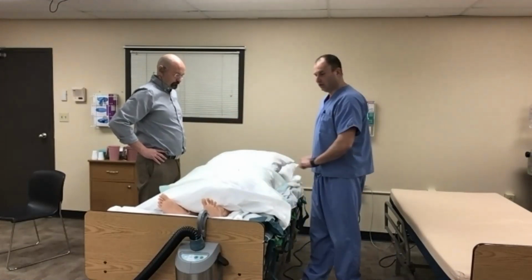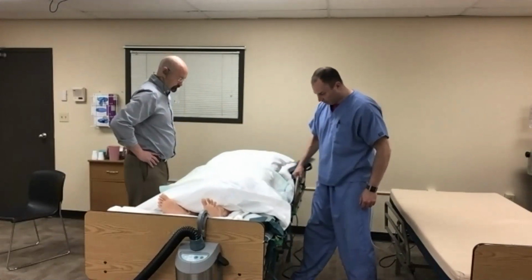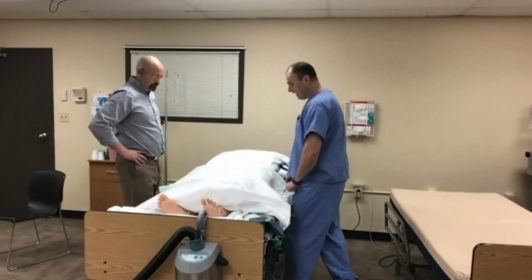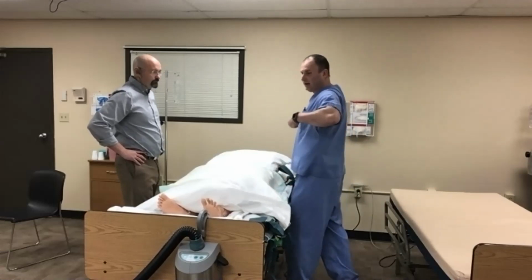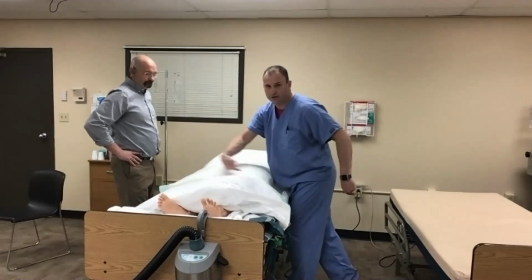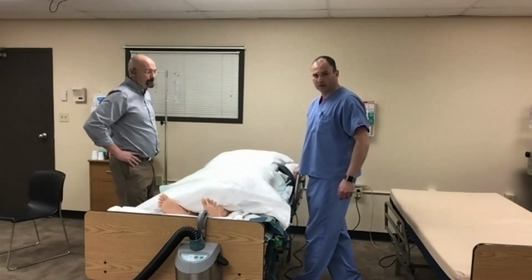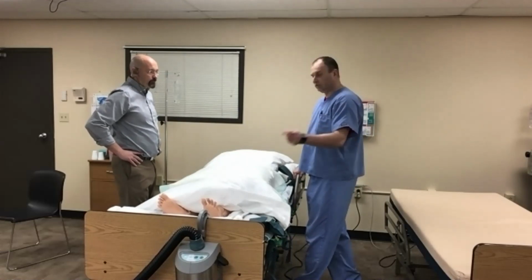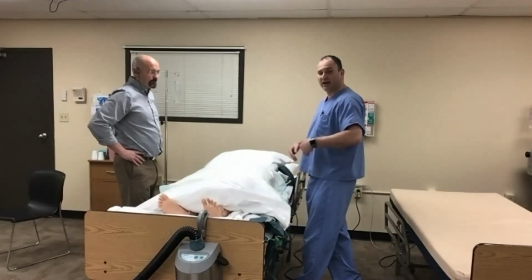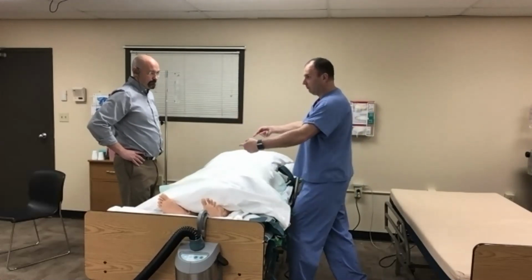So what you're going to see is we're going to come toward me first with a lateral. Even though I'm using the railing, I'm still going to keep my other leg here just so I know where the edge is. And I'm going to slide the mat up the railing, up my body a little bit. We're going to leave it inflated so that Chris can then tuck these pillows underneath George so that when we prone him, they're still underneath him. It sounds long, and we're doing it to demonstrate it, so it'll take a little longer, but when you're doing it in real time and you have more people, it's slide, up, tuck, tuck, tuck, prone, okay?